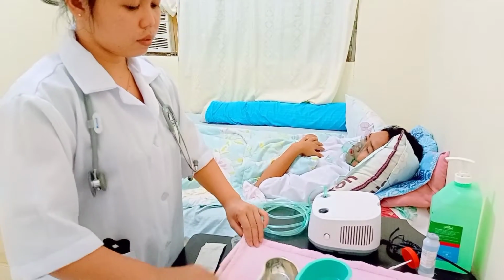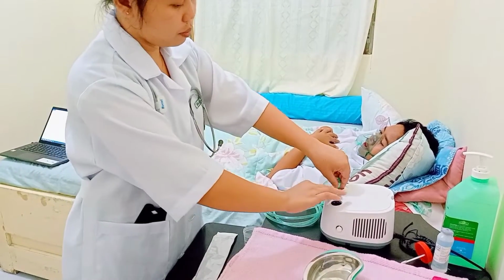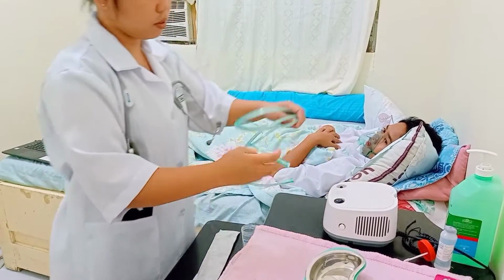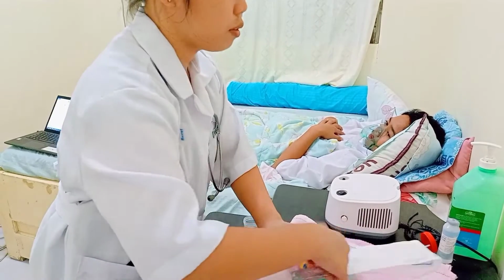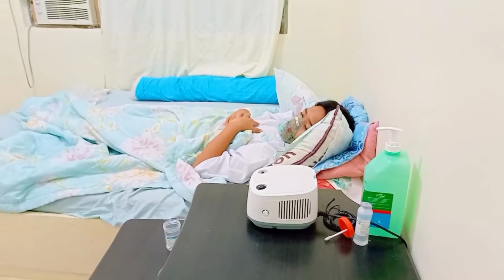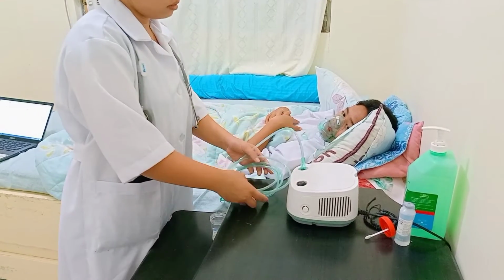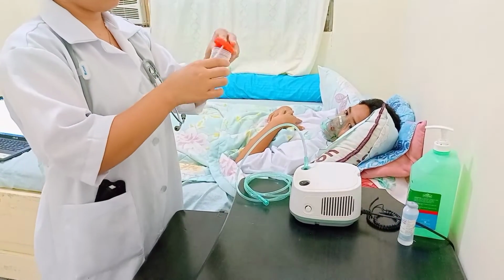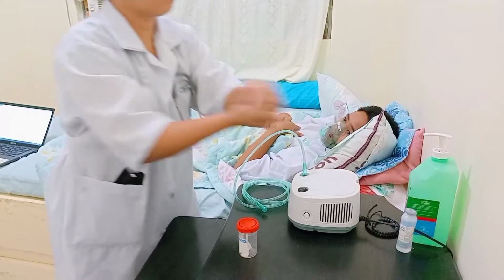And next, dispose of equipment and ensure availability for the next suction. Also change the suction tubing and container daily. Ensure that supplies are available for the next suction. And also perform hand hygiene for infection protocol.